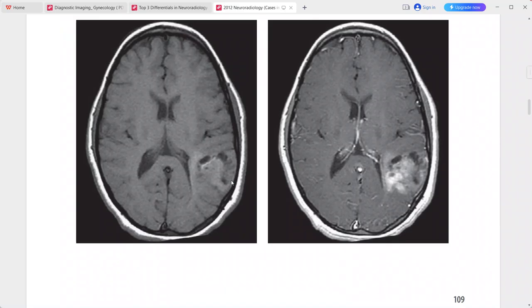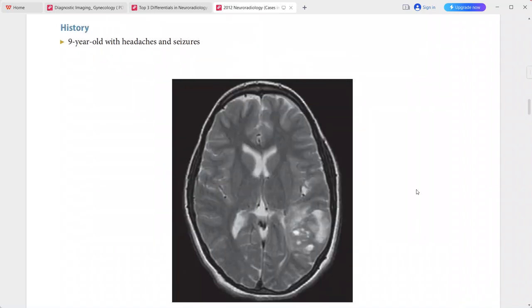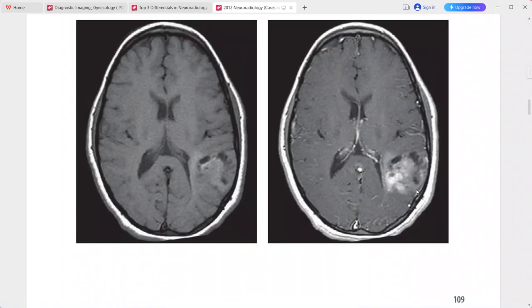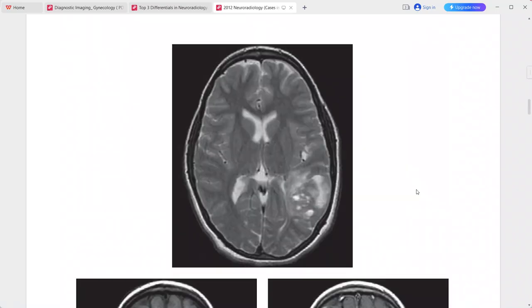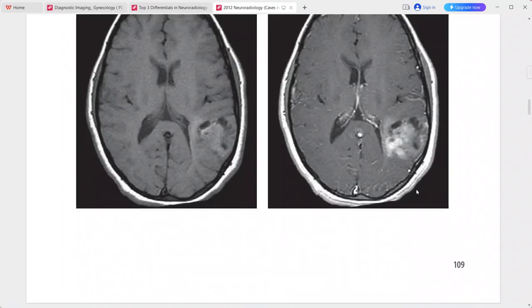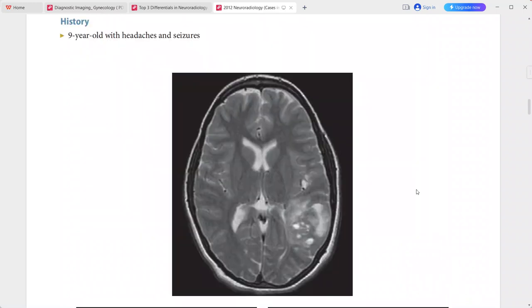There is linear dural enhancement adjacent to the mass. These imaging characteristics are typical for pleomorphic xanthoastrocytoma. Differentials include ganglioglioma, pilocytic astrocytoma, DNET, and oligodendroglioma.